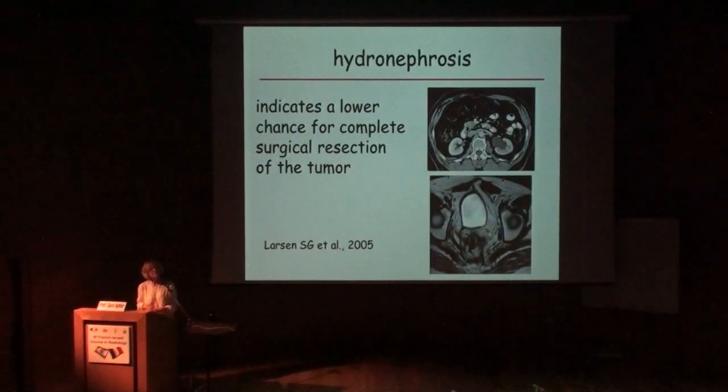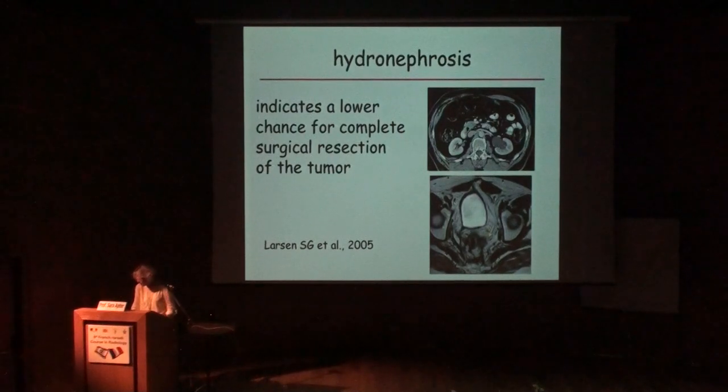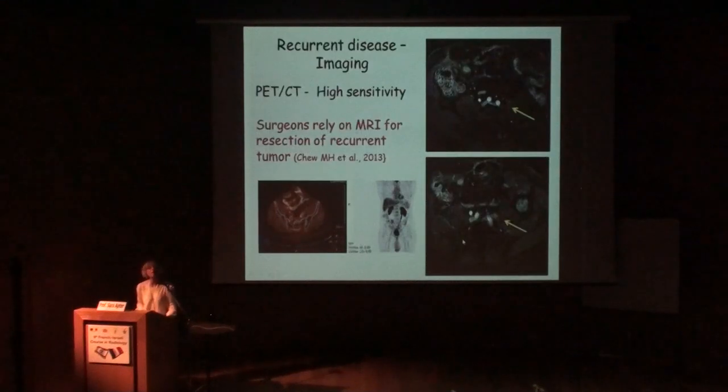And this is the last patient that I want to present. A patient comes back, he had a low anterior resection, as you see, and he comes back with a hydronephrosis, and you see the mess. Most of the recurrent masses are in the surgical site or in the pelvis, so that's okay, we can understand. Is that mass causing that hydronephrosis? Most probably. But what bothered us was that we didn't see the ureter coming up to that point. So we looked more carefully.